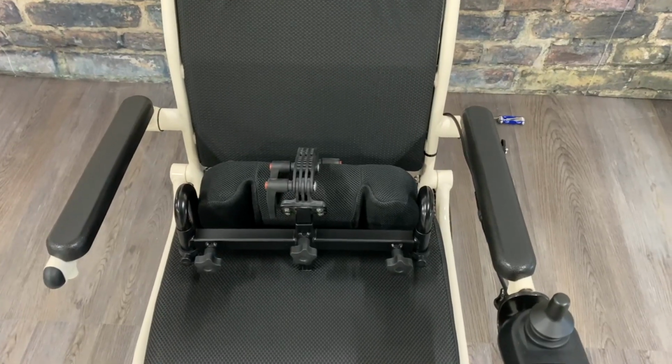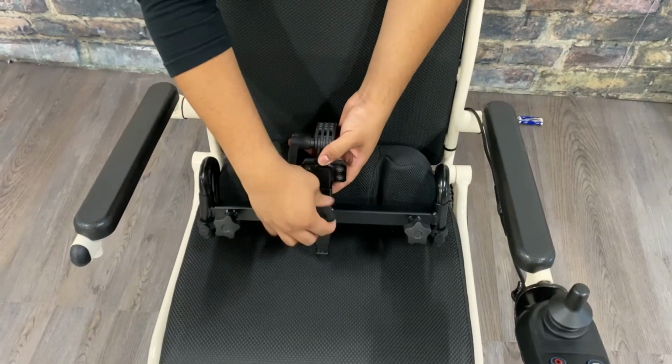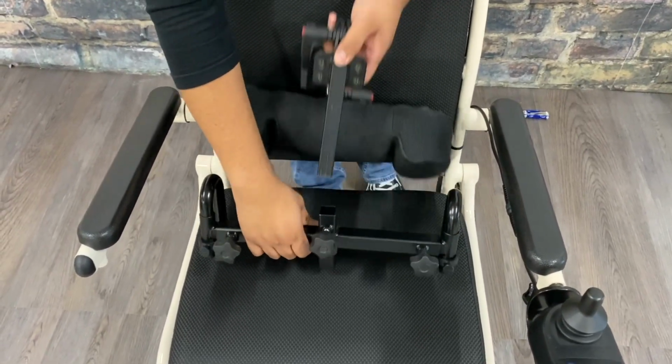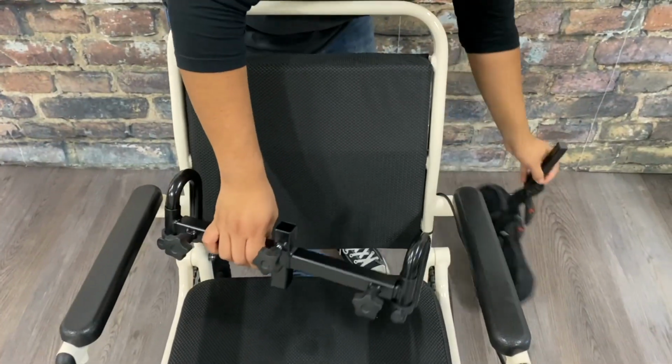In this video, we're going to show you how to install the headrest on your MagSHOCK. The headrest comes fully assembled, so the first thing you'll want to do is loosen up the center bolt and remove the headrest piece itself.